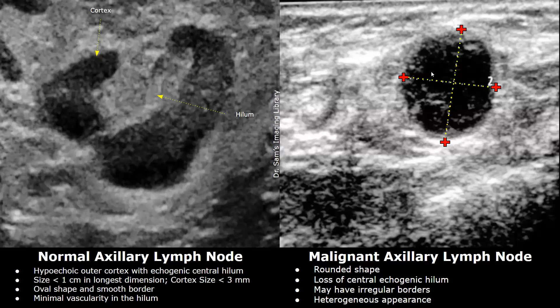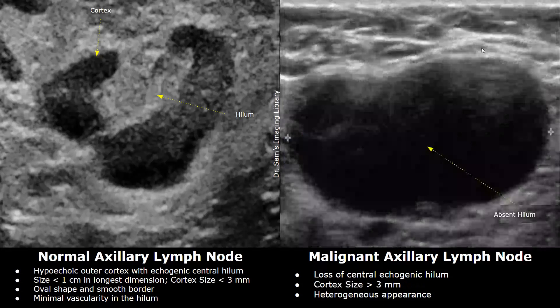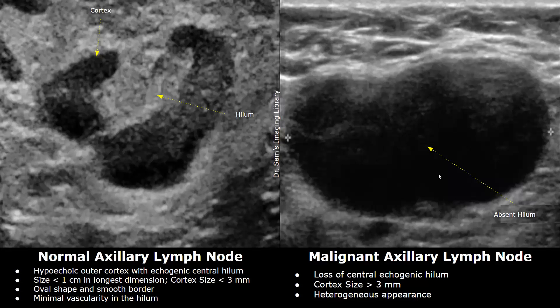The lymph node may also have irregular borders. This is another image of a malignant axillary lymph node — the central echogenic hilum is absent, and there is increased cortical thickness. The main feature is the loss of the central echogenic hilum.